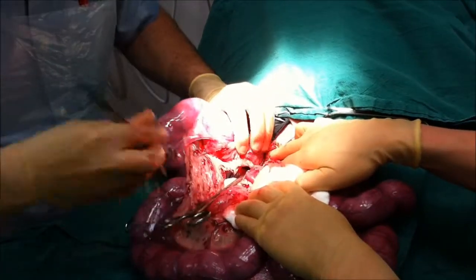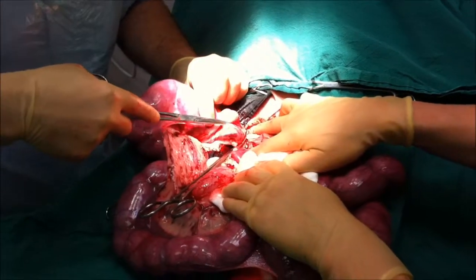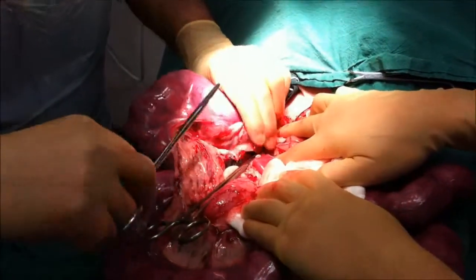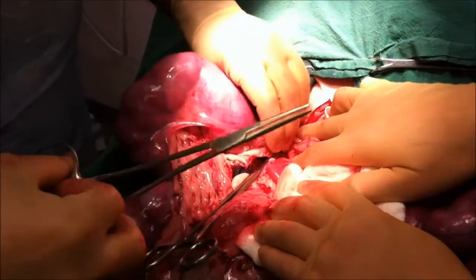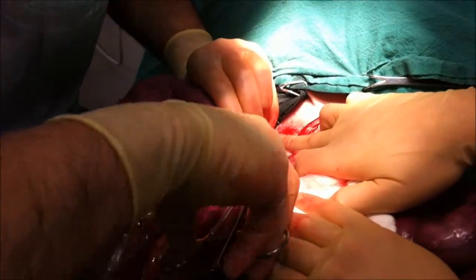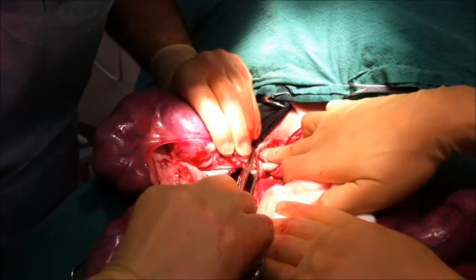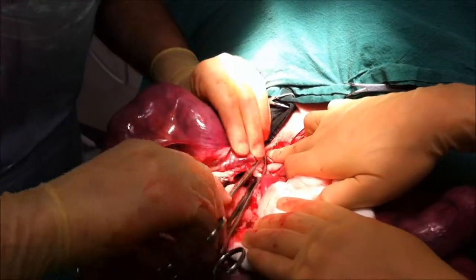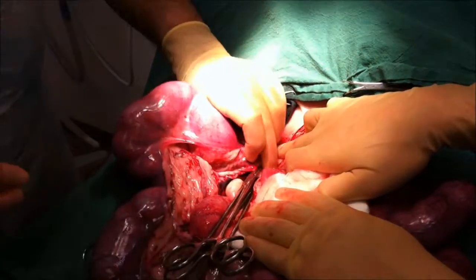We're just putting some clamps on here. This is the blood supply for the ovary — the ovary's in here, and you can see a follicle sitting just here. There are very big blood vessels here because of all the inflammation going on. We're going to put some clamps right across there, which will allow us to tie off all the blood supply and cut through to detach it.